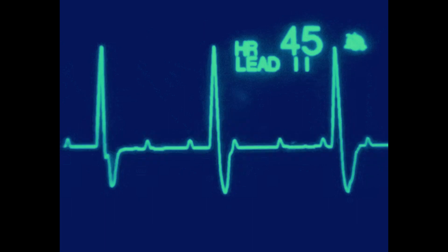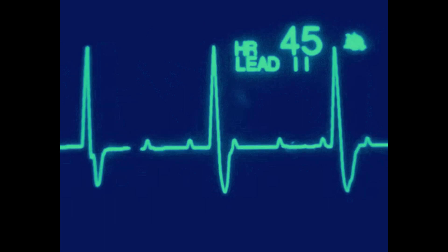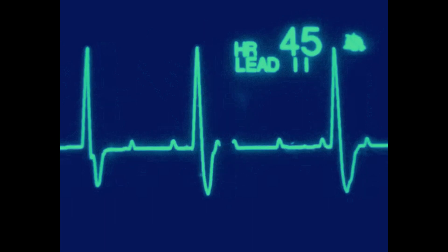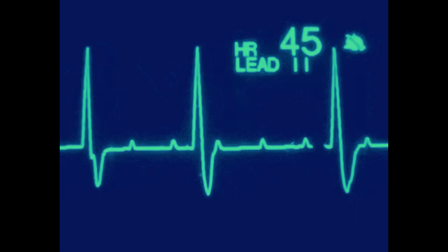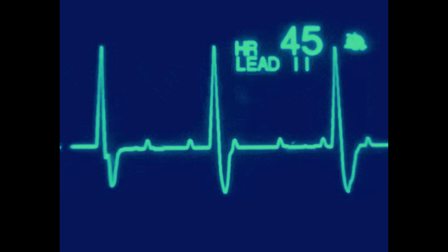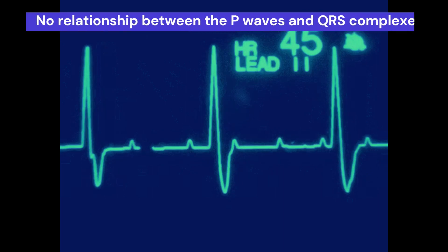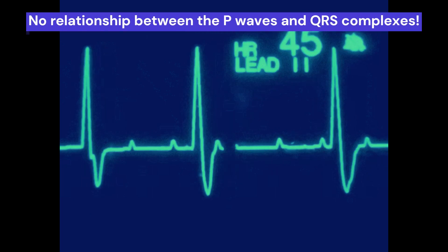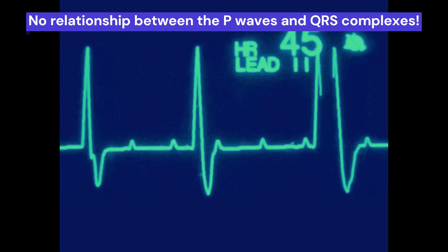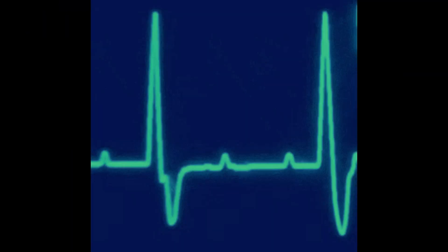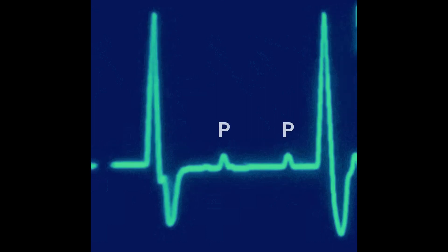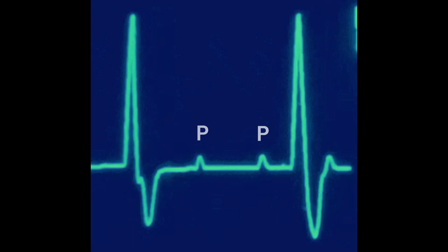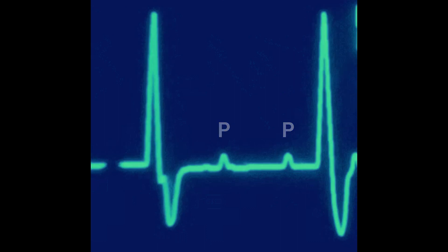As a result of this dissociation, the QRS complexes on an electrocardiogram will appear at a slower rate than the P-waves, and there will be no relationship between them. The P-waves may be absent or may appear at a different rate than the QRS complexes, depending on the underlying cause of the block.